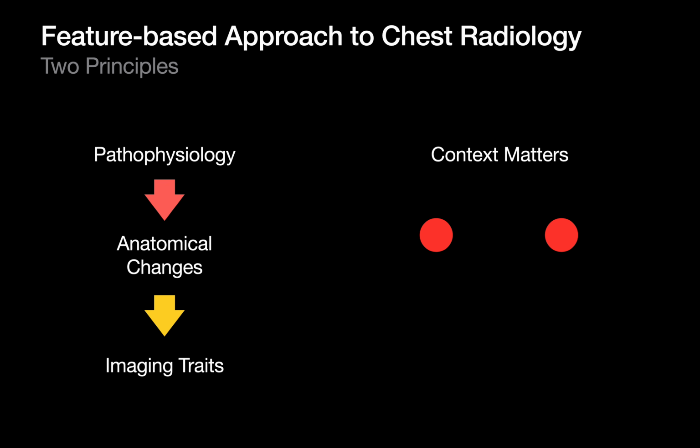Different imaging modalities may reveal different aspects of that appearance better than others, but the underlying structural problem is the same. So the frameworks we're going to build aren't really chest X-ray frameworks or chest CT frameworks, they're lung frameworks. We can use them on radiographs, we can use them on CT, and when appropriate, we can use them on MR.